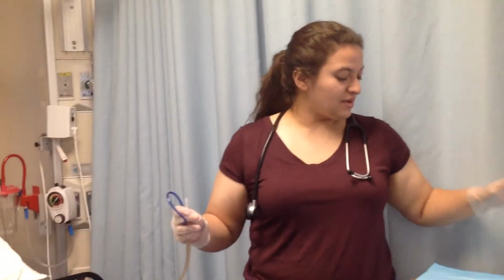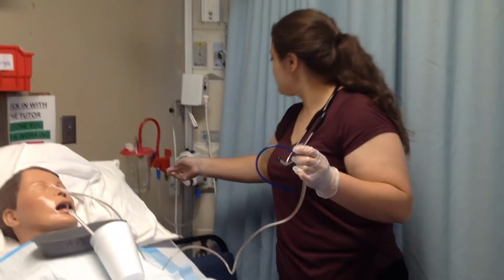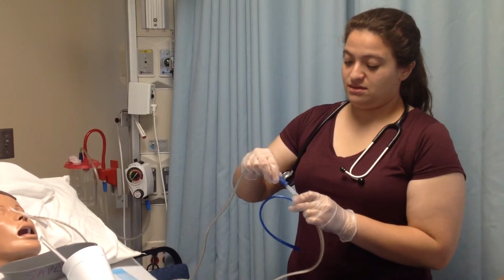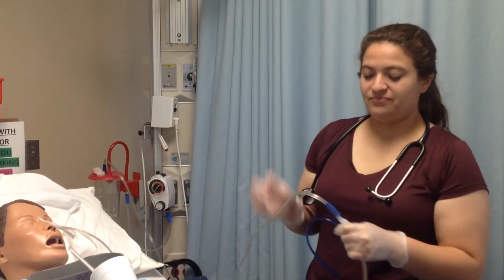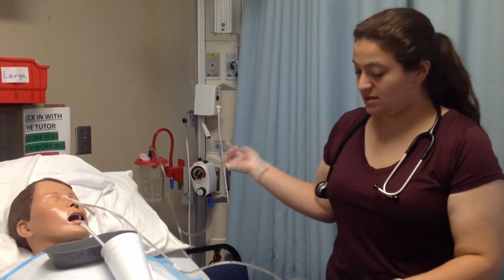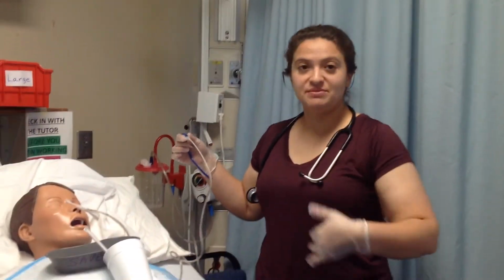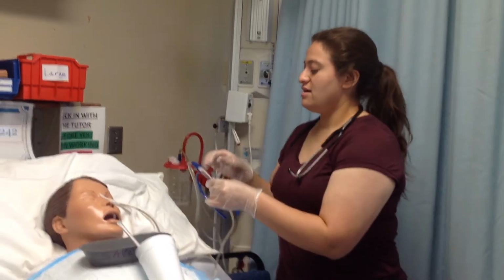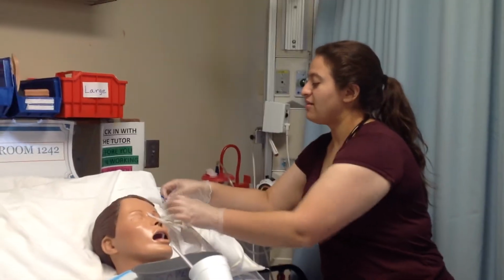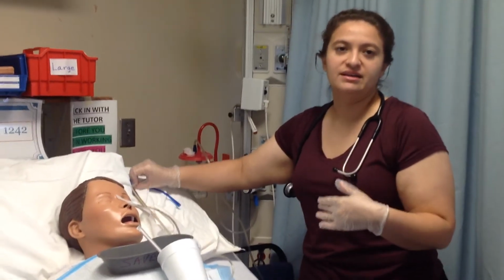And then once I've done that, I would put my syringe to the side, uncap this, and then I would use this. That's when the irrigation would start, or the suctioning would start to remove the stomach contents. And I would make sure to put this above the patient's bed or abdomen. I don't want to put it below the abdomen, because then no suctioning will occur. So I would want to either safety pin this, or just make sure that it's out of the patient's way and it allows the patient flexibility.